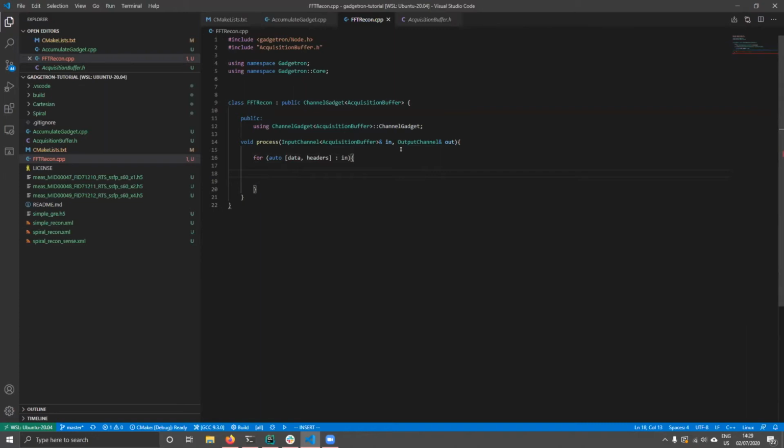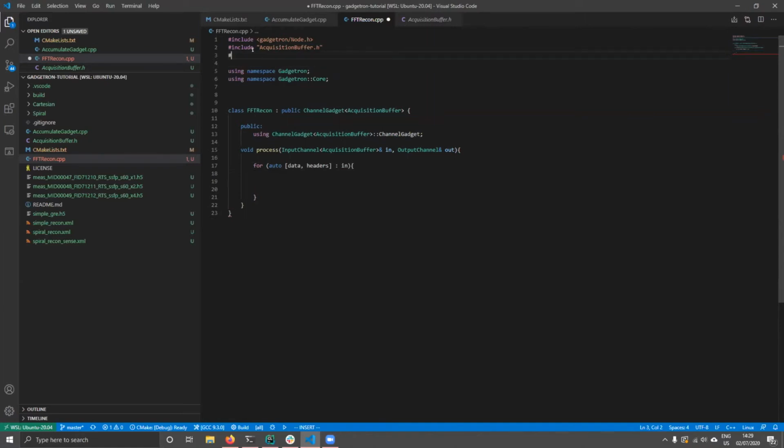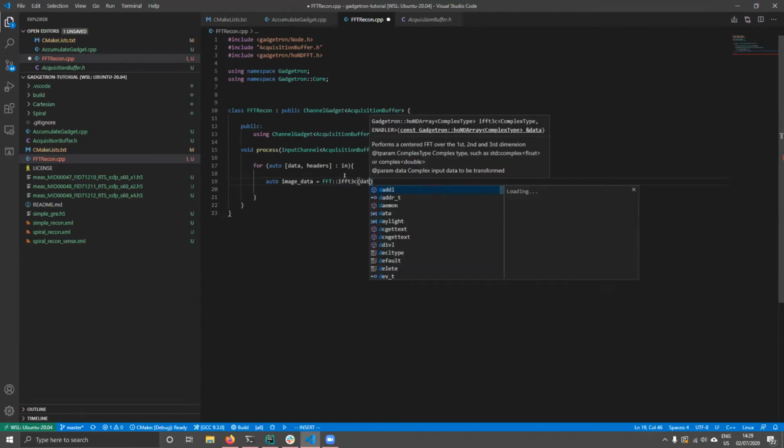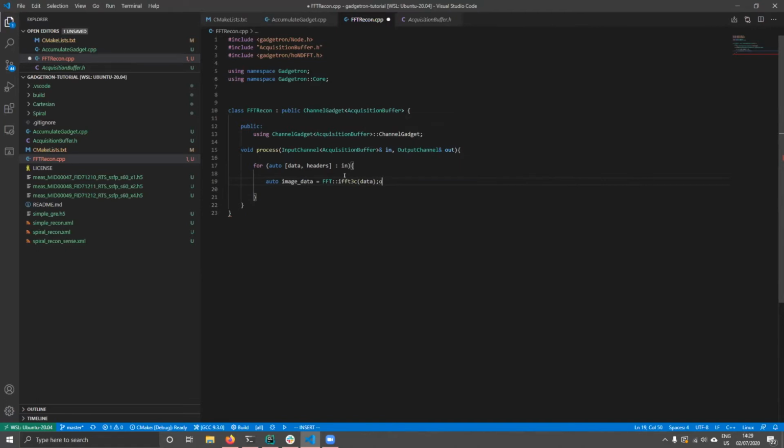Now, this gadget is just going to work for fully sampled MRI. So what do we need? We need a Fourier transform. So let's grab that in Gadgetron. And we're going to make a new variable, do an inverse FFT on data. That was easy. An ISMRMRD image consists of two parts. We have the data and we need an image header. So let's make that.